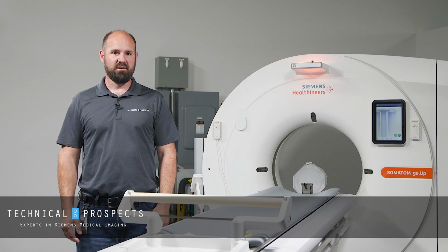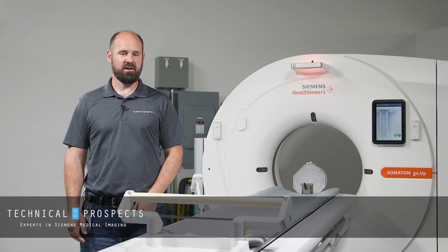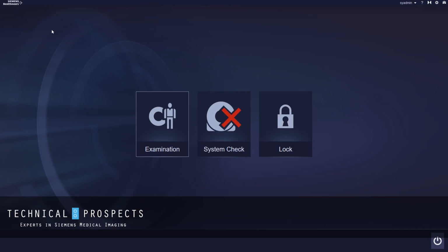In this series, we're talking about the SOMATOM Go with Syngo Native. Today, we're going to learn how to fix your online help content. A useful function within Syngo Native is your help, which you'll find in the upper right-hand corner, either clicking the question mark or hovering and selecting help.